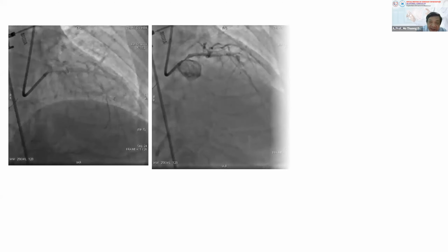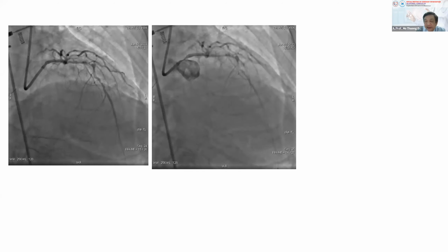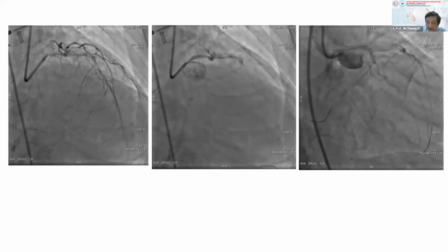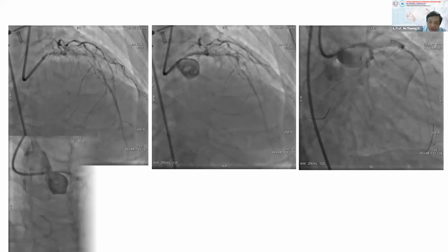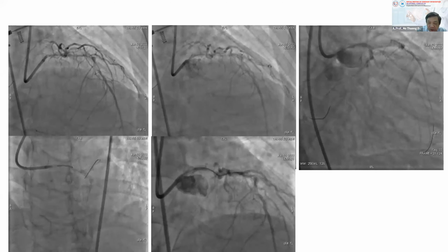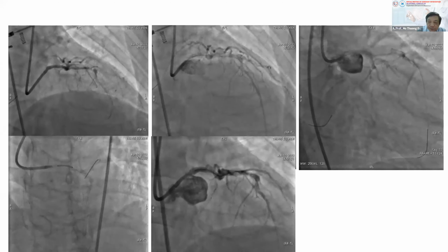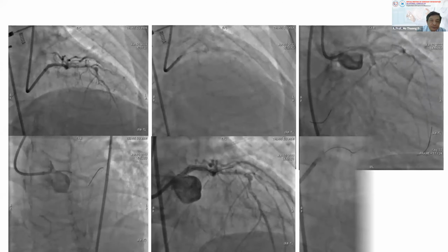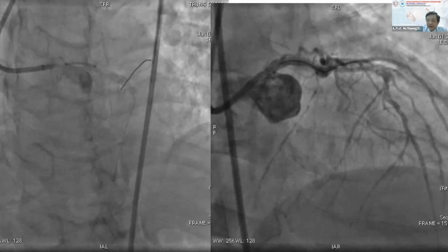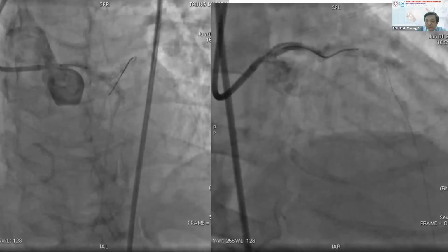So when I check again, something is wrong in the ostium of the left main. I must deploy a stent in the left main immediately, because of slow flow into all the left main in a patient with the last remaining vessel. Very quickly, stenting from the ostium to cover the left main. Okay, after I deploy the stent covering the left main, everything is okay and becomes stable.